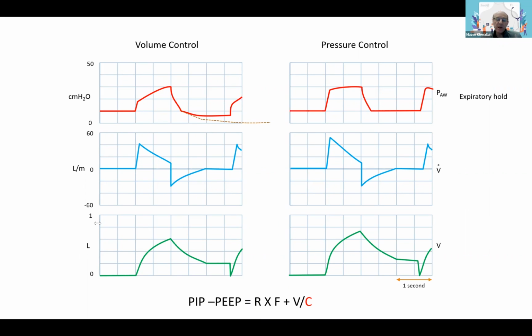Now, those are the difficult cases where you need to think about, first, in conventional mode of ventilation, it's really difficult. You need to find a balance where you're minimizing the air leak and keeping oxygenation. If you can find that balance, if you decrease the PEEP to 10 and the leak is not that much, you're able to compensate for it, excellent.